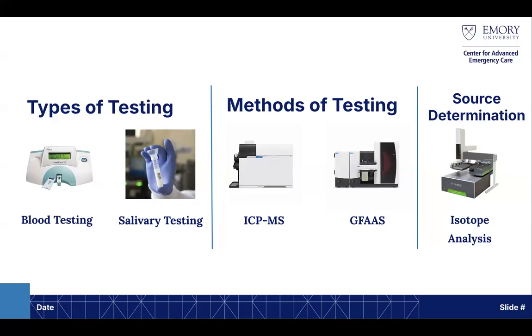The beauty of the LeadCare analyzer is that you're able to ship the machine to a country where this technology is not available, and also purchase the test kits and perform these easy studies. My first study, done in the Republic of Georgia in 2015, used the LeadCare analyzer, and it was an easy way to screen 235 children in a short period of time with a limited budget.